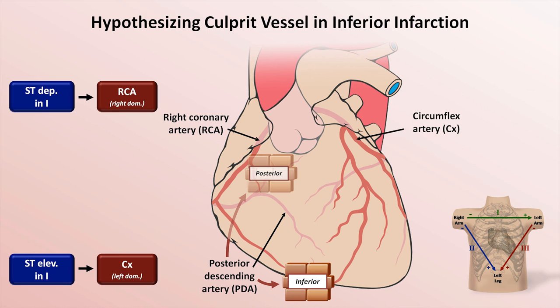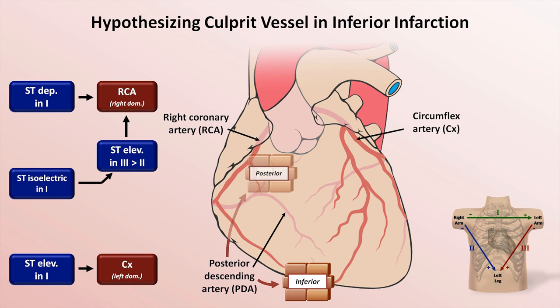The tricky one to remember is if the ST segment in lead 1 is isoelectric, which is the most common scenario. In this case, it depends on how the ST elevation in lead 2 compares to that in lead 3. You can see that lead 3 is angled more to the right, so it makes sense that if the ST elevation in 3 is greater than 2, the RCA is more likely to be the culprit vessel. Whereas if the ST elevation in 2 is greater than or equal to 3, the obstruction is more likely in the circumflex.